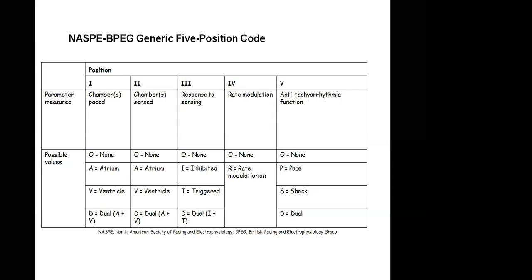It tells you that when P waves occur, there's a time interval in which you expect a QRS, right? Yes. And for patients that have complete AV block, meaning that there were multiple P waves but no QRS, that's the reason why you're putting a pacemaker on the patient. So you now program it such that when there is a P, I will set a time interval to allow for intrinsic QRS, meaning that if it exceeds that time, then I must pace.